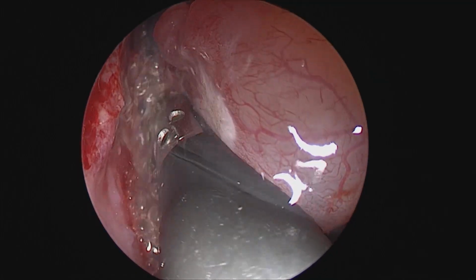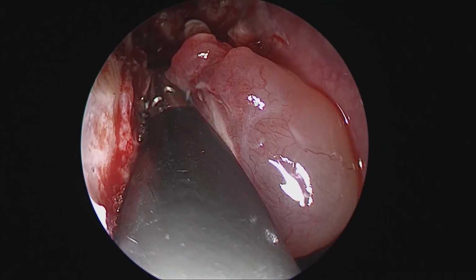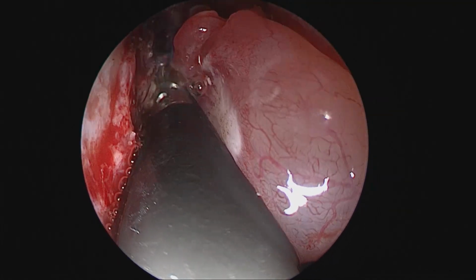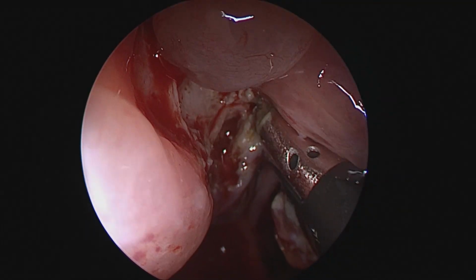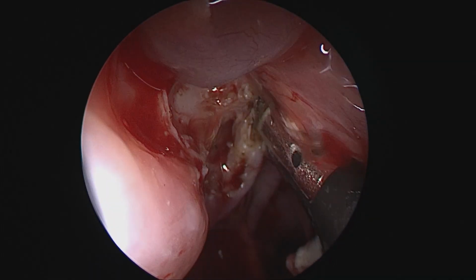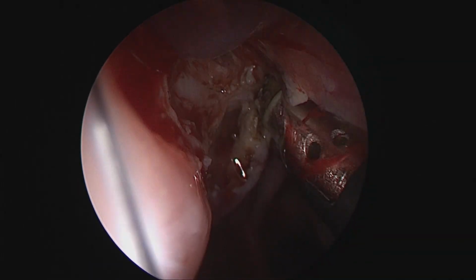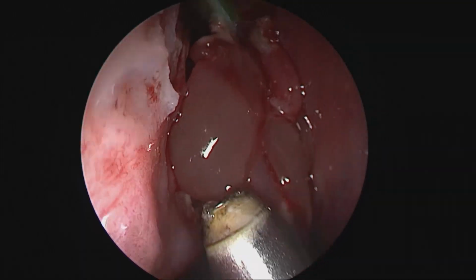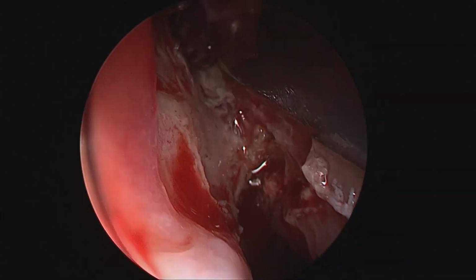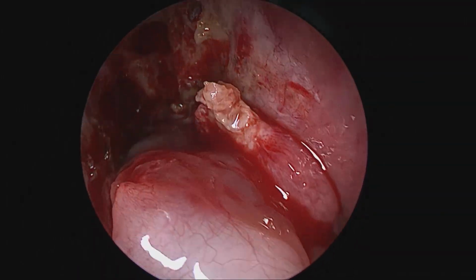As you see here, we are constantly coagulating progressively backwards, trying to completely bare the bone of the lamina papyracea, all the way back to the sphenoid sinus, from the anterior to the posterior ethmoids, so that we are very, very certain that no mucosa or no periosteum has been left behind while removing this tissue.